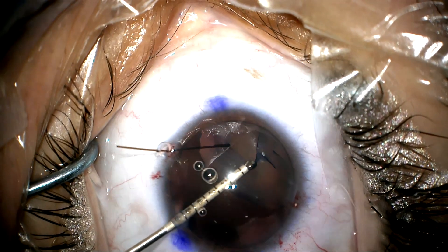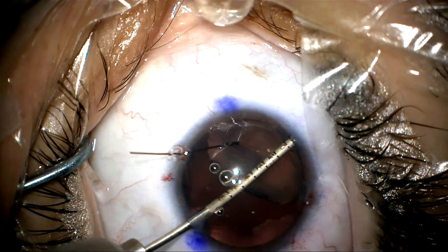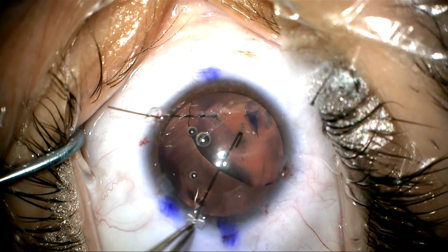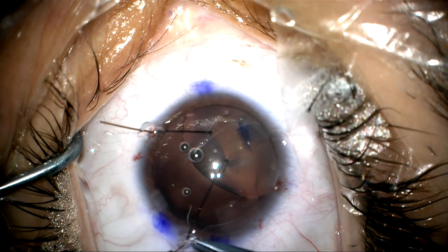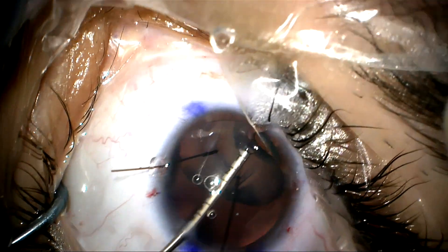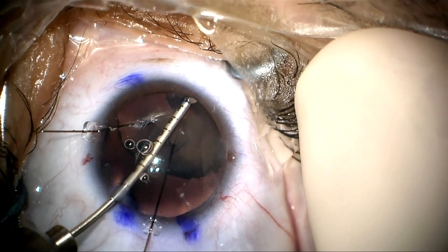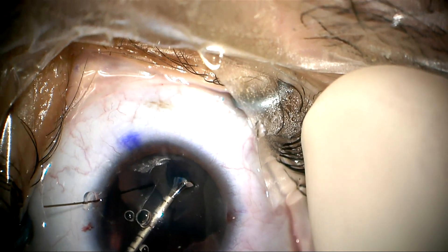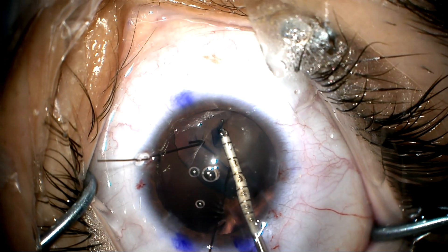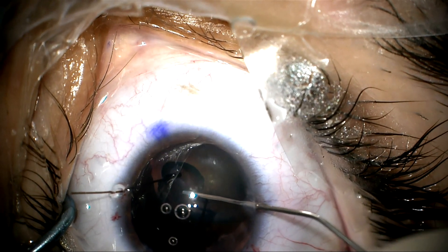I'll use my left hand because it's going to give me a better angle. Coming from the left side, I'm going to tear away from me using that iris retractor to supply counter-traction. The problem is I'm going to have to go under the iris where I cannot see, so I'm going to add another iris retractor to try to provide some counter-traction. I'll pull the lens over just a little bit and use my left hand to continue the tear. Going under the iris where I can't see is a treacherous part of the capsulorhexis, so we have to be really careful to make sure the rhexis doesn't tear out. But the rhexis is completed.